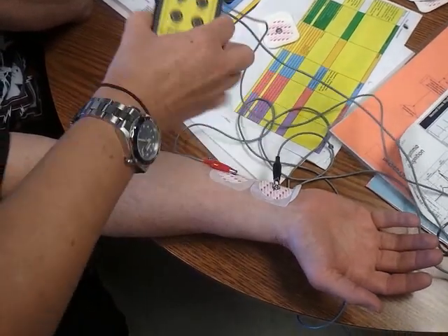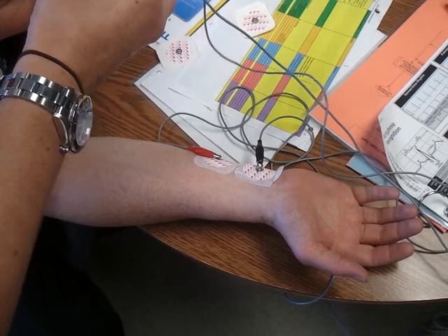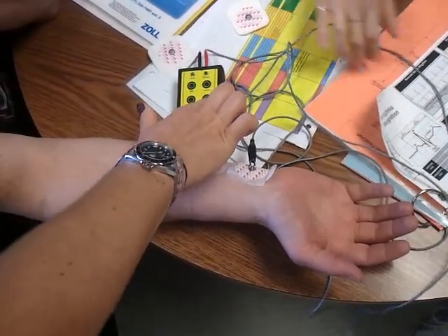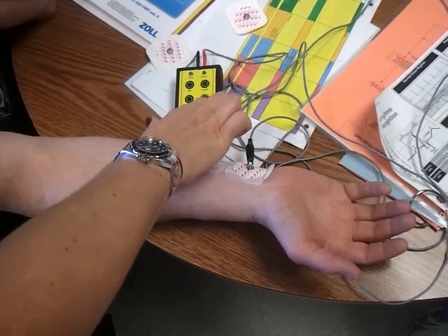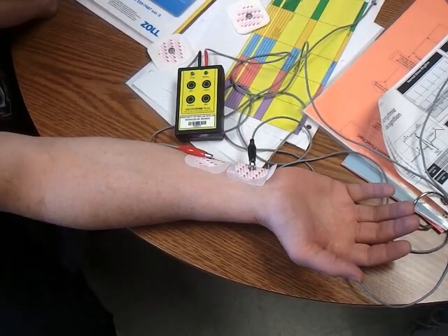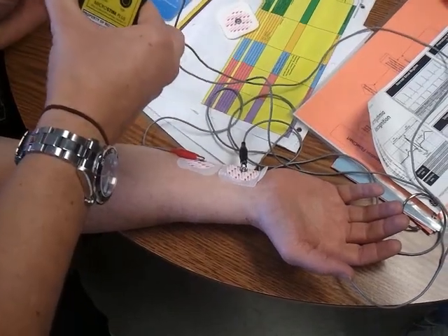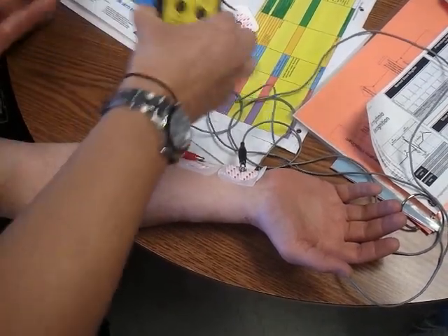And everyone's different. I responded at a four and my husband responded at a five. We'll see how much Dave can handle. This is a three. Nothing. I can feel it. You can feel it. But we didn't see any twitches. That's because my nerves are dead.